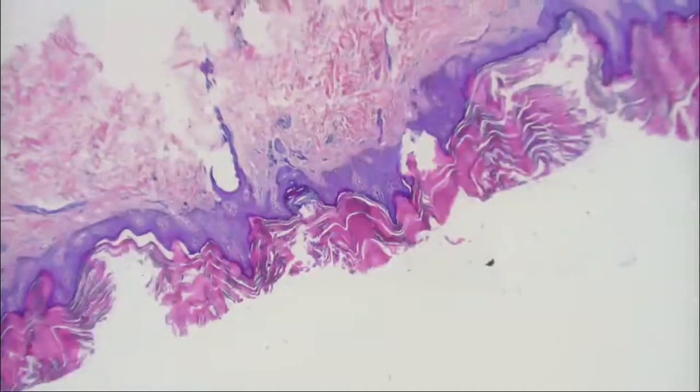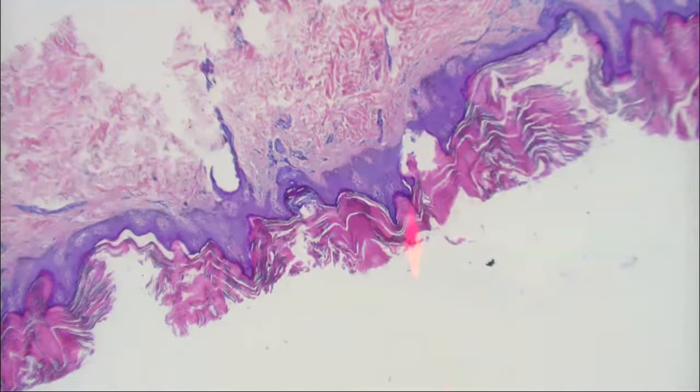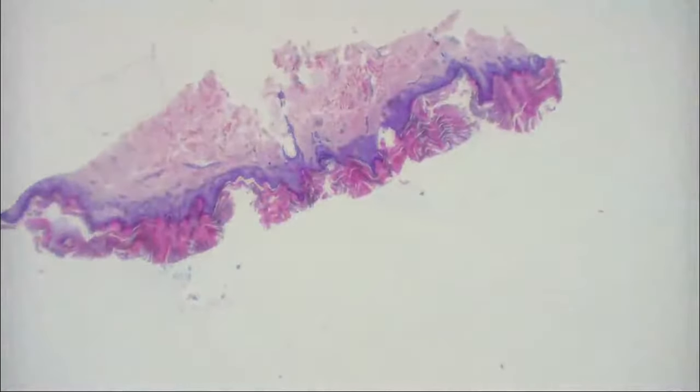All right, we allow people to change their minds, so that's okay. So maybe you're thinking pityriasis rosea. Well, that usually doesn't give the digitated epidermal hyperplasia, does it? That's usually more of a slight spongiotic dermatitis with mounds of parakeratosis and lymphocytes with extravasated erythrocytes. So this has definitely got something going on that's wrong with the epidermis. For sure, yeah. I mean, it kind of looks like a seborrheic keratosis, doesn't it? Yeah, for sure. It'd have to be like a macular or stucco keratosis.